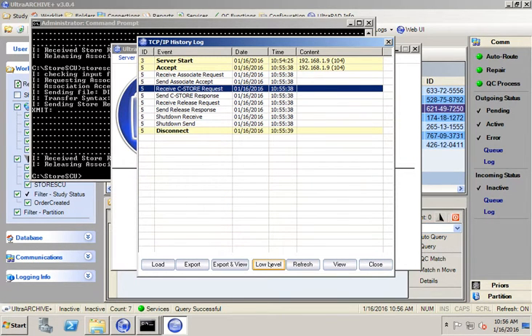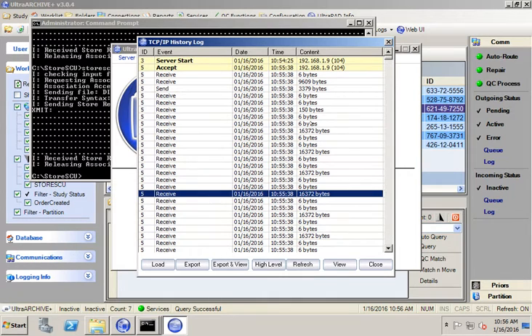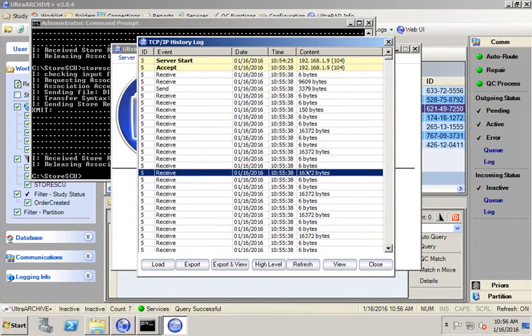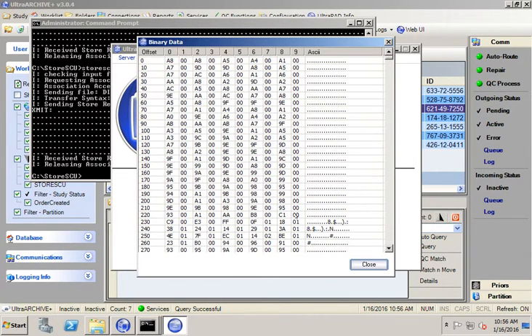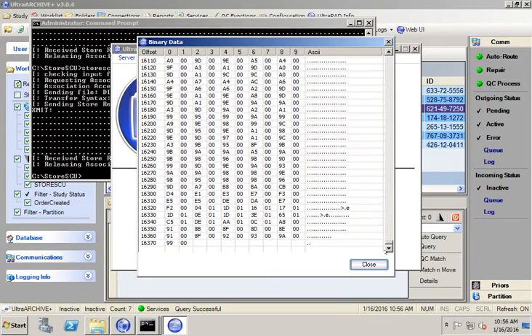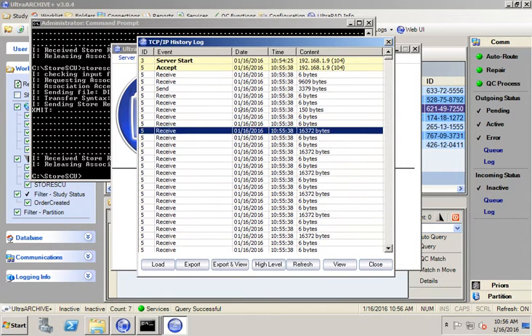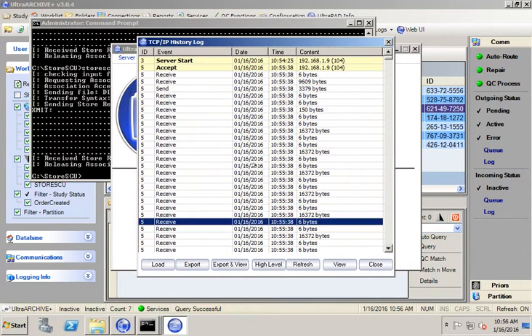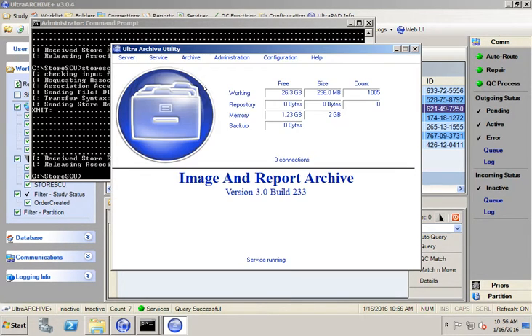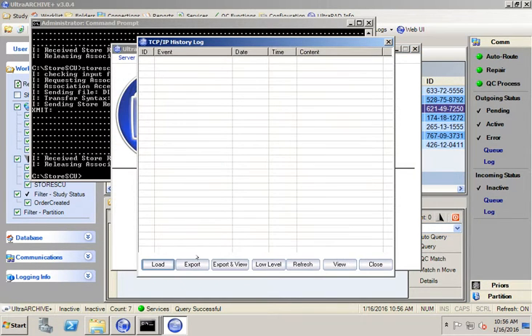If you want to look at the actual packets, you can do that. So if you look at the actual hexadecimal data that's being sent, you can click on low level. Low level has a lot of information in it, but each one of these is a DICOM PDU. So if I double click on it, you can see the actual traffic. So this gives you a very low level of logging, but this is very useful for UltraRAD when we're trying to troubleshoot certain issues. So we'll occasionally ask for this type of logging. So that's a log file for receiving.